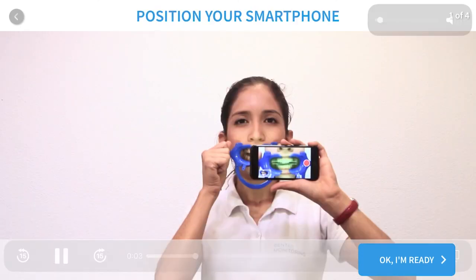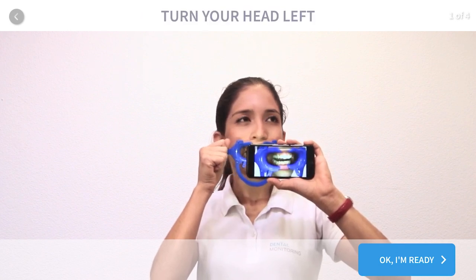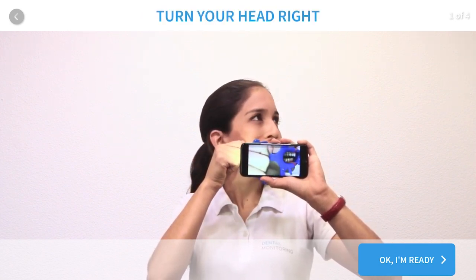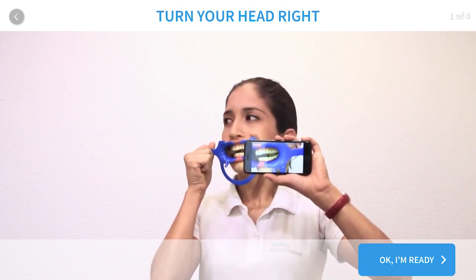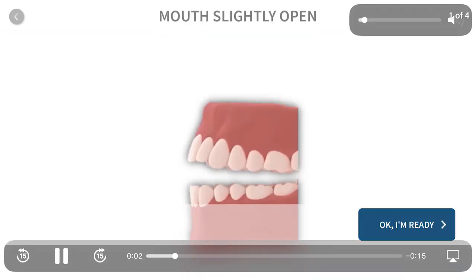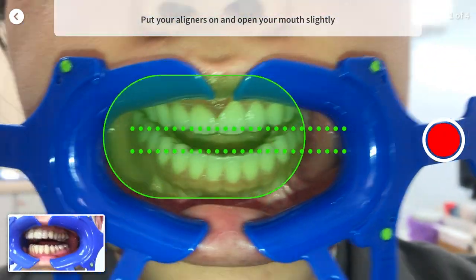When starting, there should be a short clip showing you how to take the first scan. After watching the clip, click OK, I'm ready. Ensure that you have your aligners on, then click yes, next.